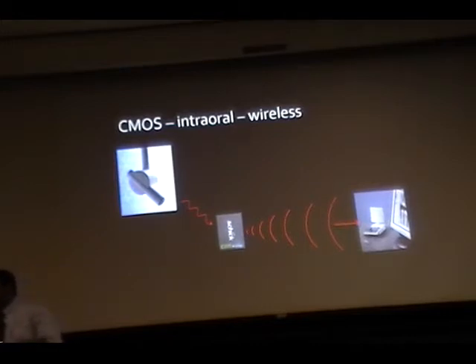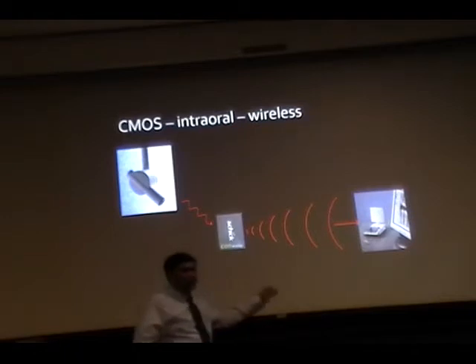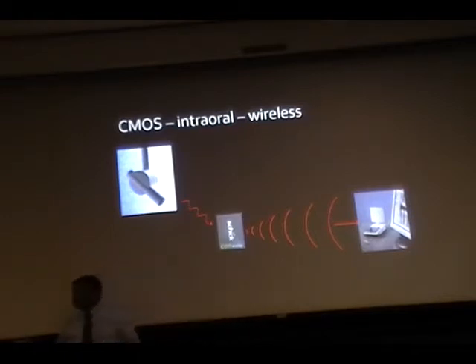So bulkier or heavy in the patient's mouth. If they're going to place something like this, it will be so heavy that patient tolerance will be very, very low. That's why they are not very successful in the market. One of the reasons we are using wired is, as you mentioned, potential drop, Wi-Fi problems, electronics, and then they are really heavy in the patient's mouth. And of course, Wi-Fi, all those Bluetooth problems.